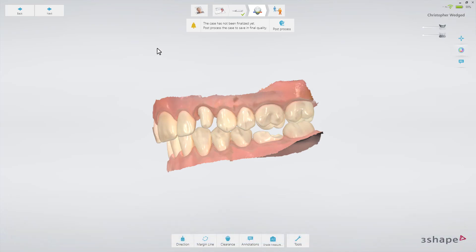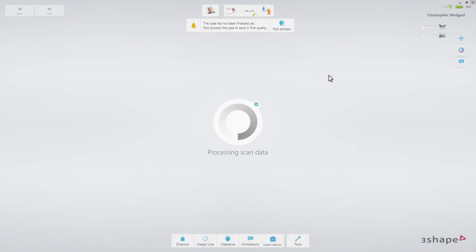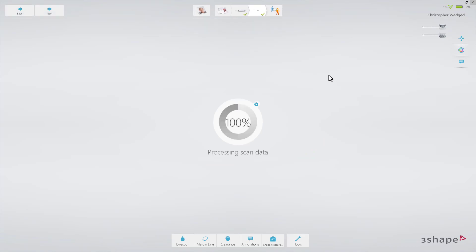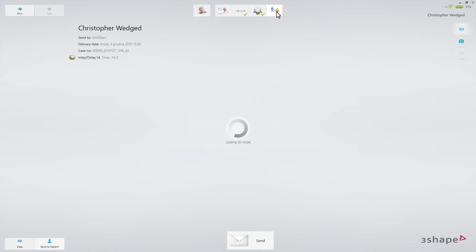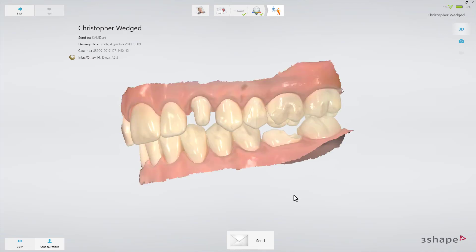Optionally, you can set the margin line. You can also add some comments on the 3D scan using the annotation tool. Finally, switch to the send page. You'll see a summary of the order. Press the send button to send the order.